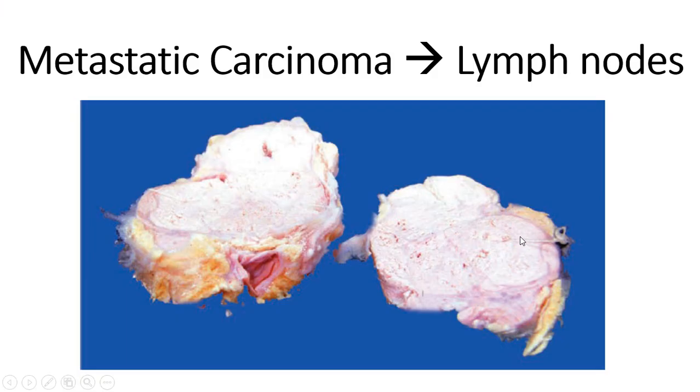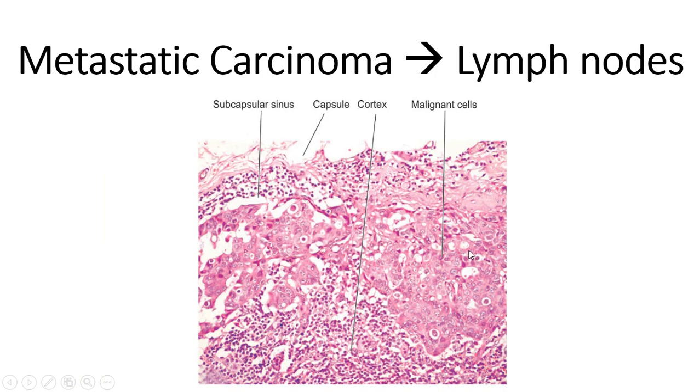Because it's malignant, it invades the blood vessels, and fragments of the tumor reach the bloodstream or the lymphatic vessels and flow into the regional lymph nodes. Here, this white spot is the tumor mass inside the lymph node. Under the microscope, there will be these orange patterns and fragments of the tumor. We call it tumor embolus, or tumor emboli.